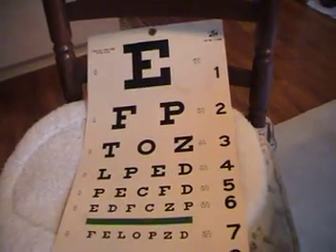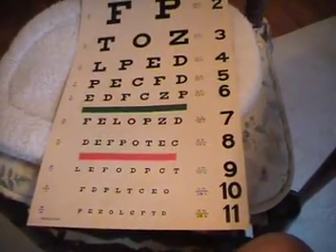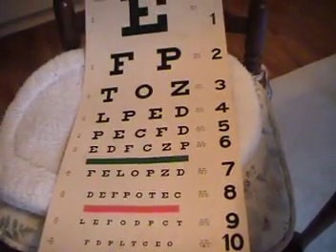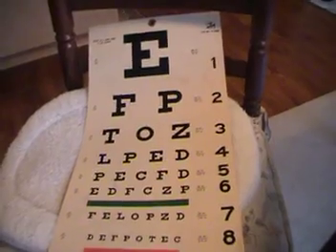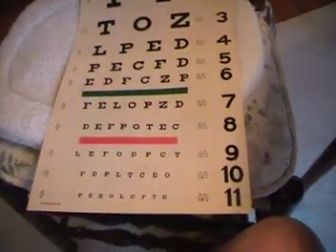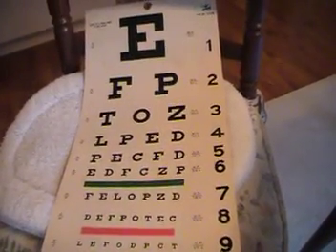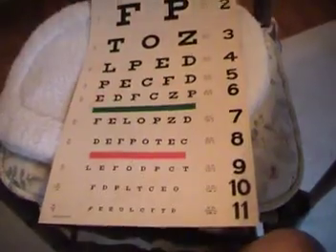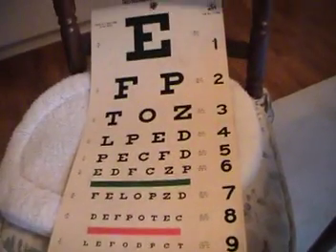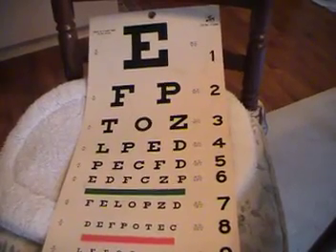This video will be about objective testing of your own visual acuity. Here's an official Snellen. The 20/60 line is about 1 inch high, which I'll use for future reference. The problem with this chart are the numbers 1 through 11. No one standing at 20 feet knows what that means.